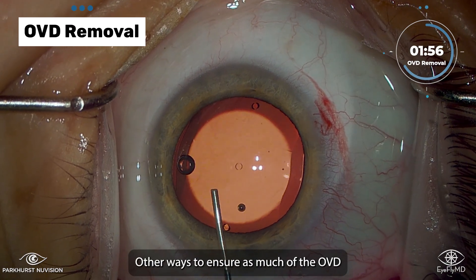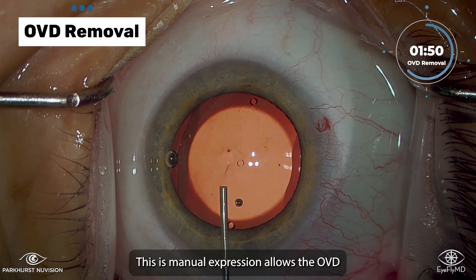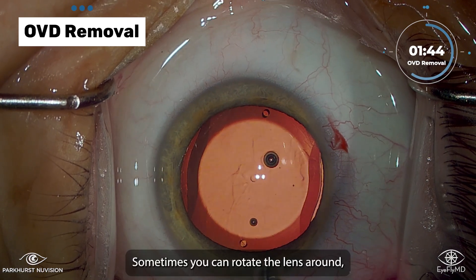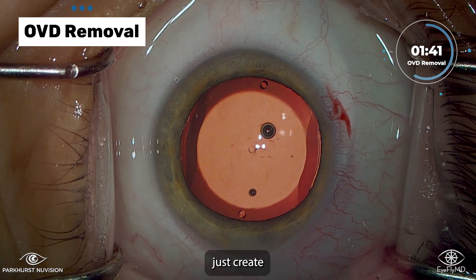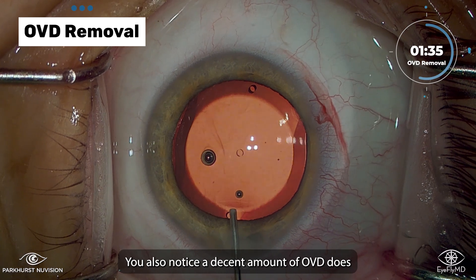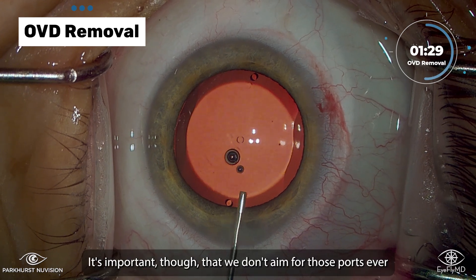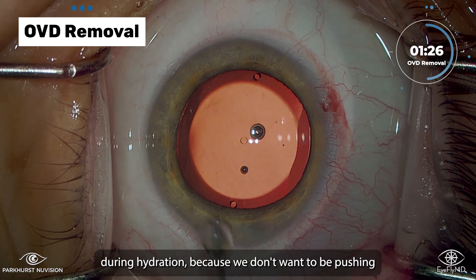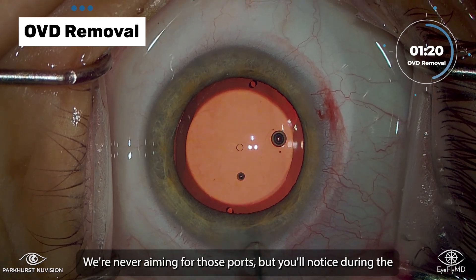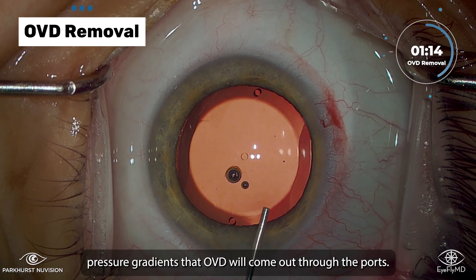Other ways to ensure as much of the OVD is evacuated as possible — you can see this rocking motion of the lens. This manual expression allows the OVD to come from around the back of the lens. Sometimes you can rotate the lens around, just to create spaces and pressure gradients to allow the OVD to come around. You'll also notice a decent amount of OVD does come out through the central port. It's important though that we don't aim for those ports during hydration, because we don't want to be pushing all that fluid under pressure right into the crystalline lens.